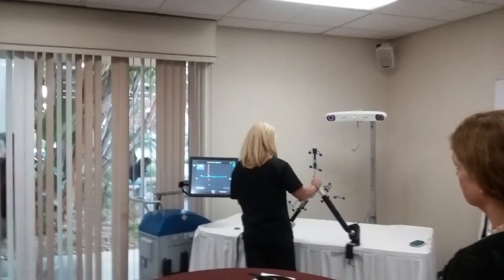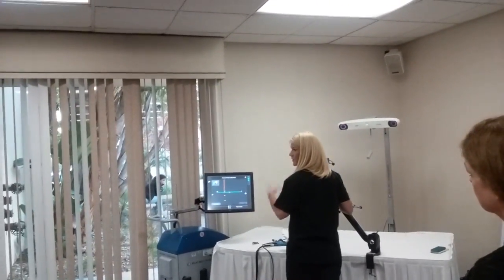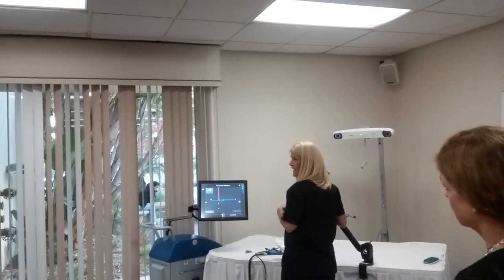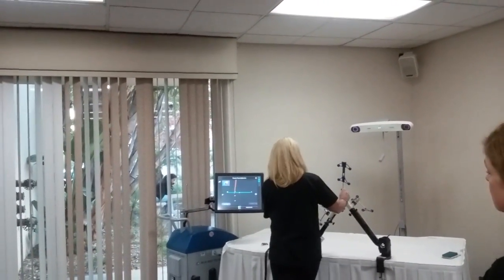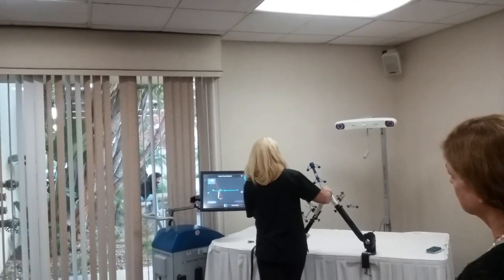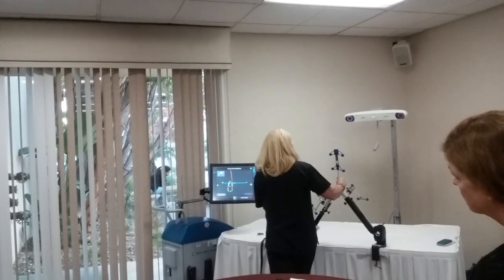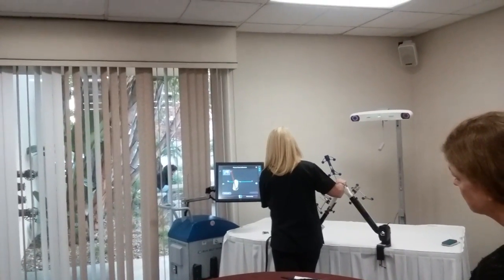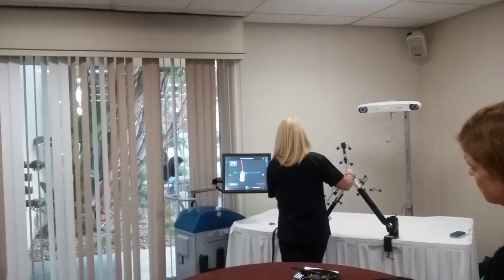So when I come in, this is patient specific. So if he came up and did his knee done and she came up and did her knee, these are going to be totally different anatomy. So what I'm going to do is basically depress my foot pedal, and you'll start to see a 3D bone model start to form for this particular patient. So any data I collect is going to help the surgeon know exactly where he needs to be when he starts cutting the bone.